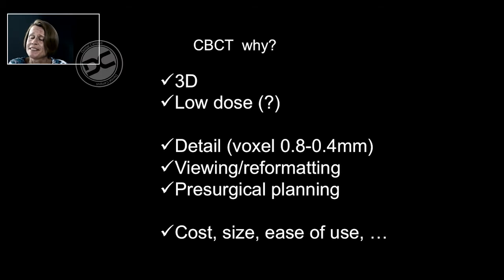It offers details even up till a level of below 100 micrometers. It offers the possibility of viewing and reformatting the images and also integrated in a pre-surgical planning system. And furthermore, it has a lower cost than CT, a smaller size, and is also easy to use.